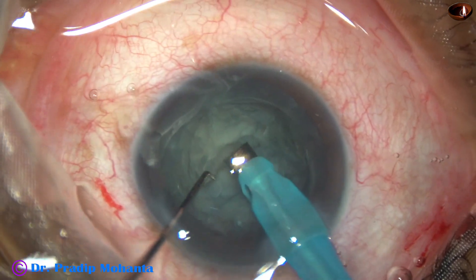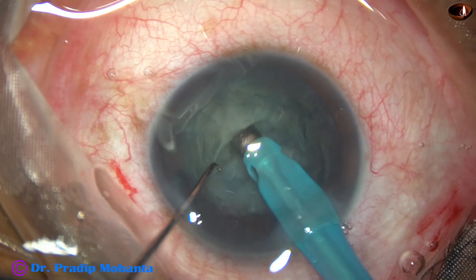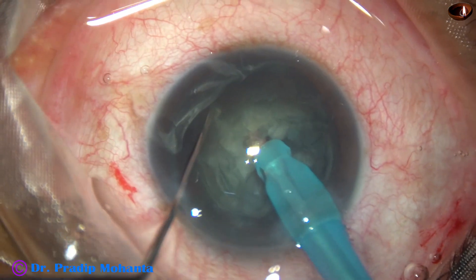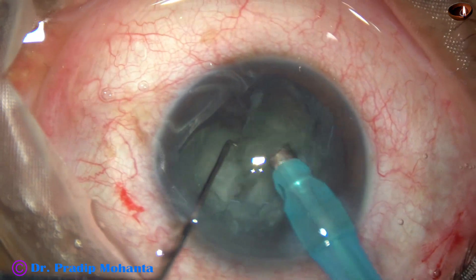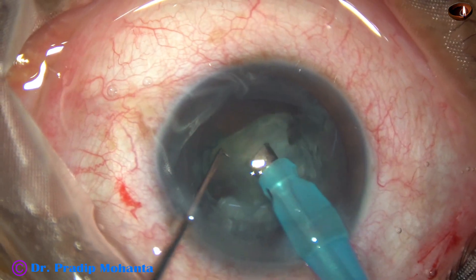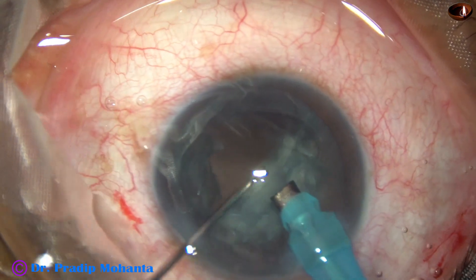The nuclear mass is divided into two fragments. Now I go to higher vacuum — vacuum at this time is about 350 mmHg, flow rate is 35 ml per minute. Each nuclear fragment is held up and emulsified, chopped into pieces and each nuclear piece is emulsified.